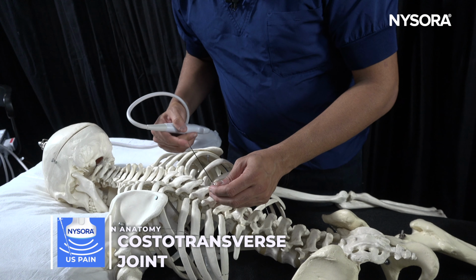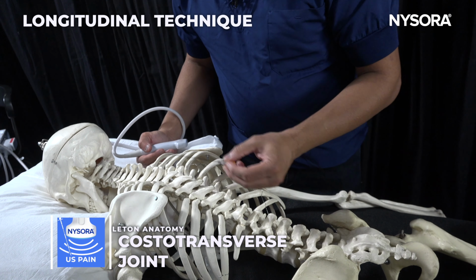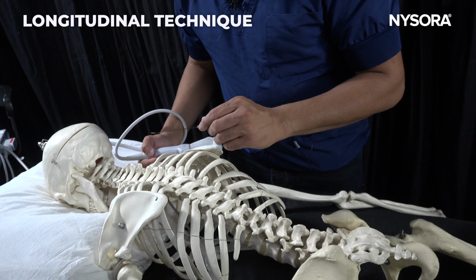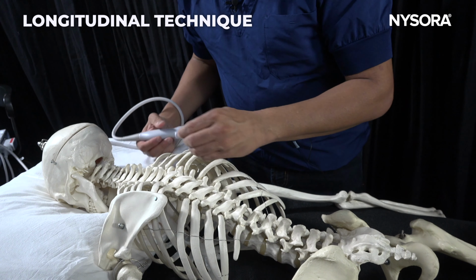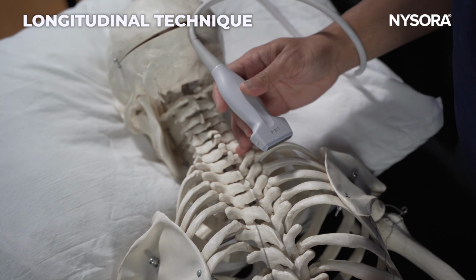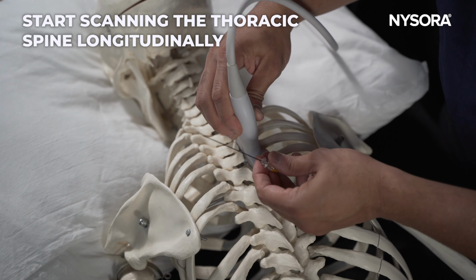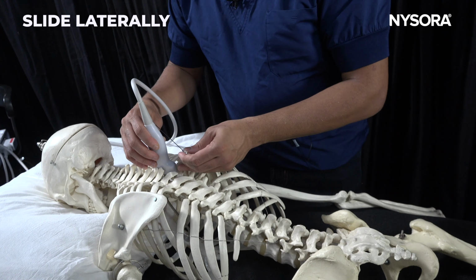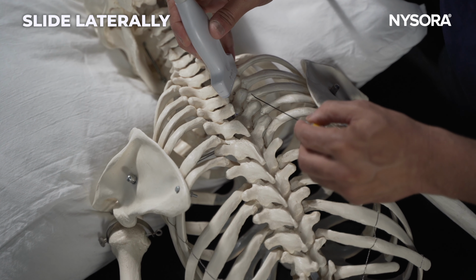So I'm going to explain about the costotransverse joint skeletal anatomy. As it says, the joint between the rib and the transverse process is the costotransverse joint. To locate this joint under ultrasound guidance, you will start to scan the thoracic spine longitudinally and moving laterally, looking for a gap between the transverse process and the rib.